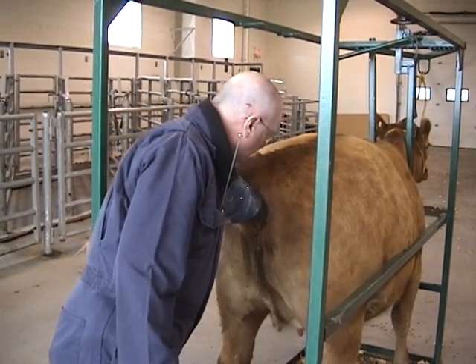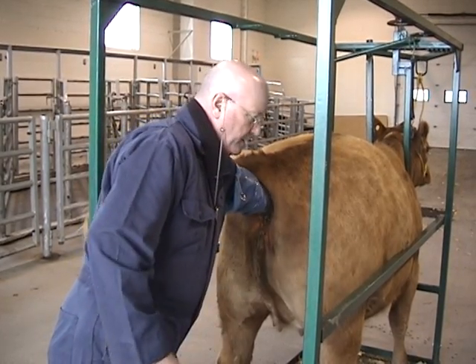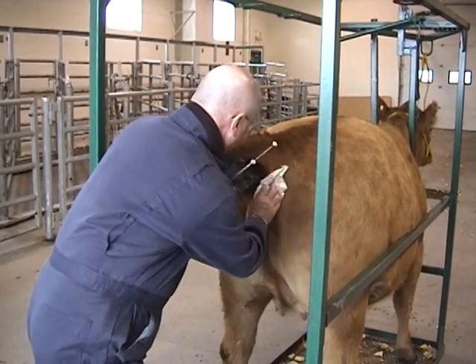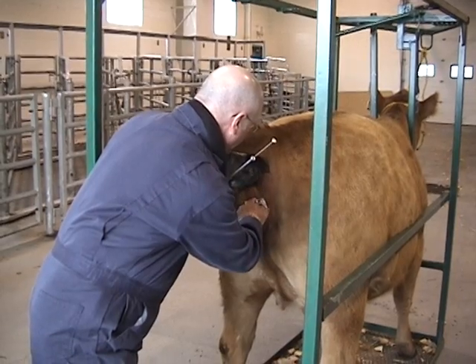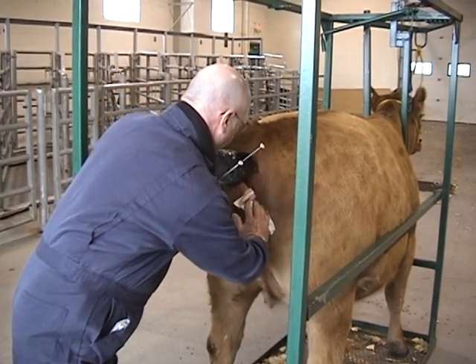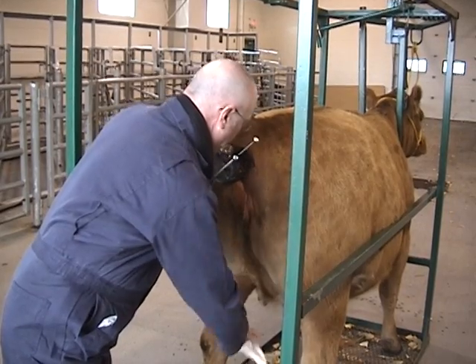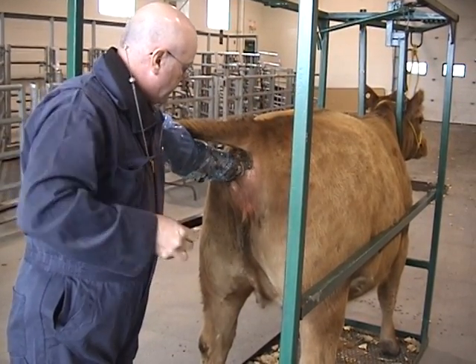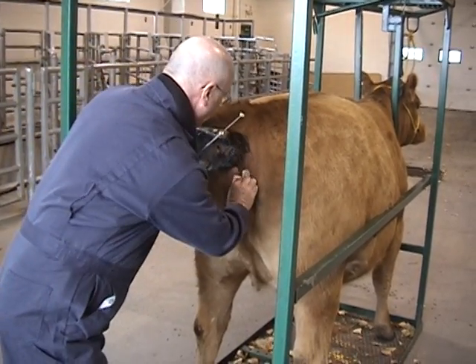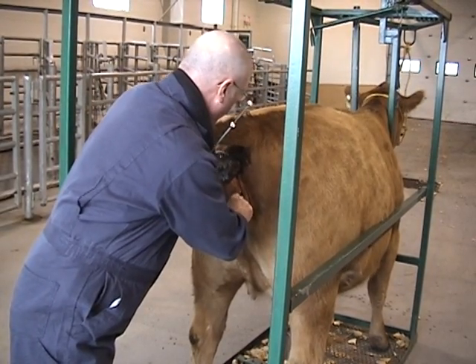Once I've got the manure out, or as much as I can, I'm going to take my paper towels and wipe it down — going down and away. I'm on the left side, going down and away, using a separate paper towel each time so I don't track unnecessary manure back where I wipe. I've got another paper towel folded up and I'm just leaving it into the cleft of the vulva lips — like so — which opens up the vulva.